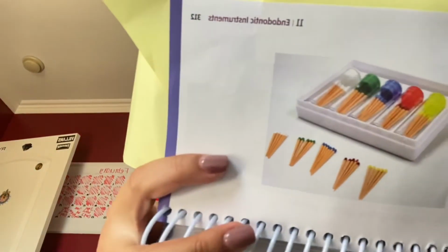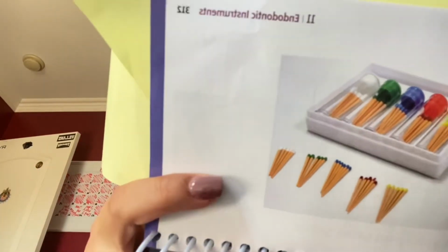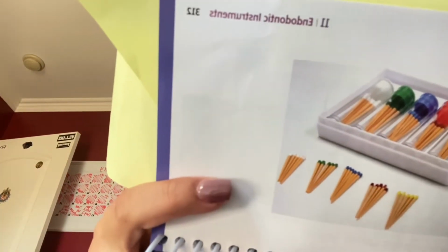And then when that is done, the doctor is going to go in with the gutta percha, the master point. This is a natural rubber used to fill the canal, and it's the same size as the K-type files. The doctor is going to put the gutta percha into the canal and make sure that it's the right size for the canal.